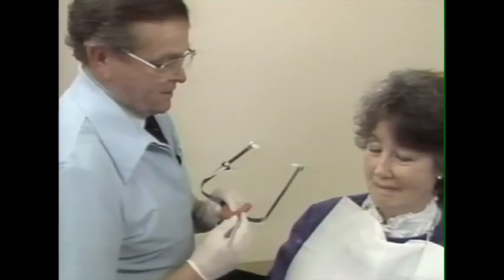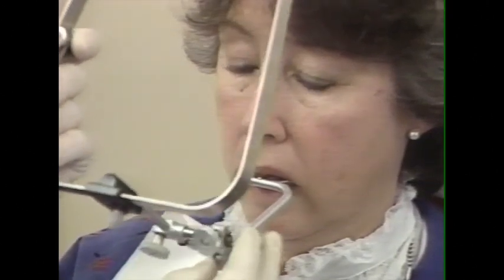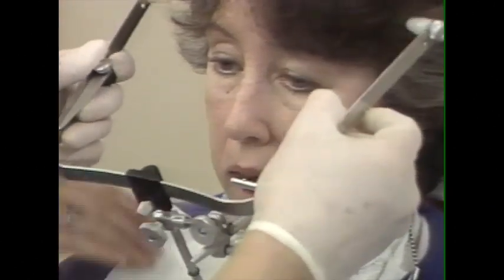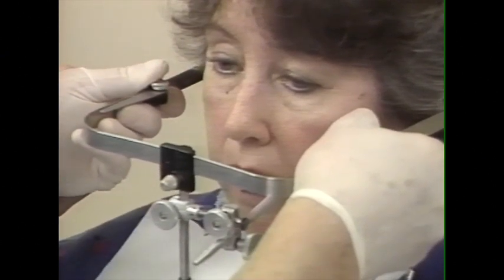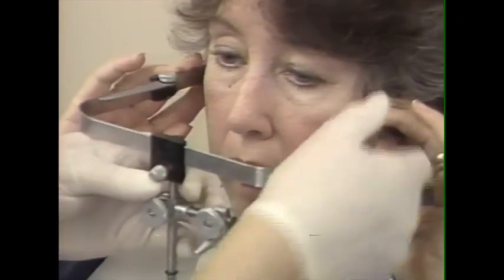Securing the Facebow record is actually a very simple procedure. We first place the bite fork into the mouth. Be sure that it's in the proper indentations. And we've previously loosened all of the clamps. We slide the number 3 clamp onto the bite fork and spread the ear rods. Have the patient help us insert them into the ears, like so.